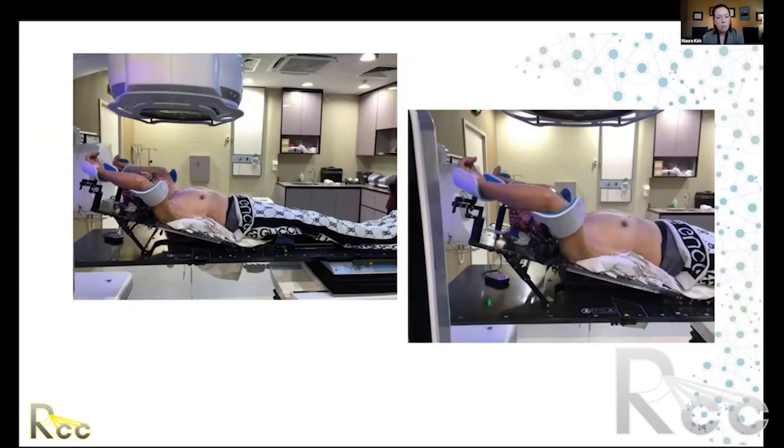Here's another example of a patient positioned on a breastboard. Again, this board looks like it has a ruler along the side. The angle is in an index position that would be recorded, and same with the arm supports here, to get that patient into the same position every day.